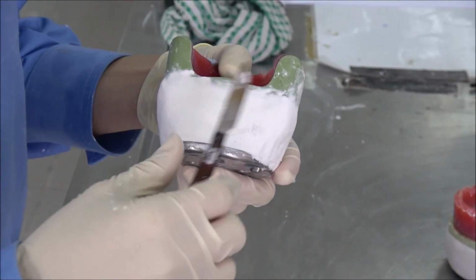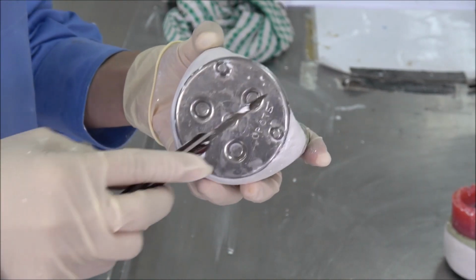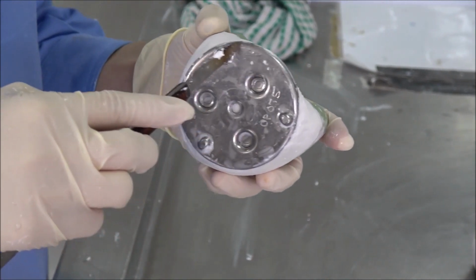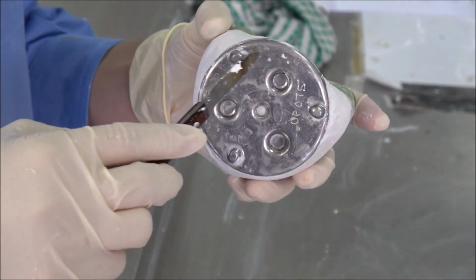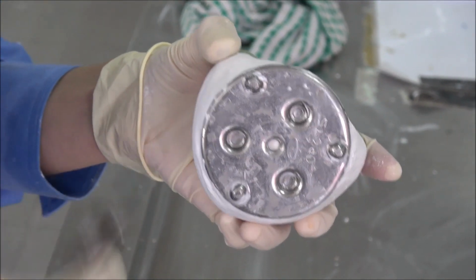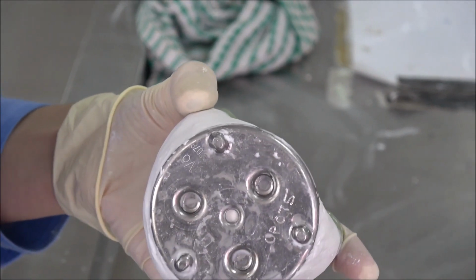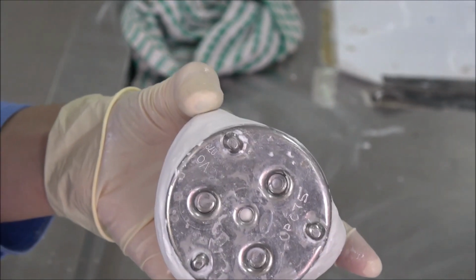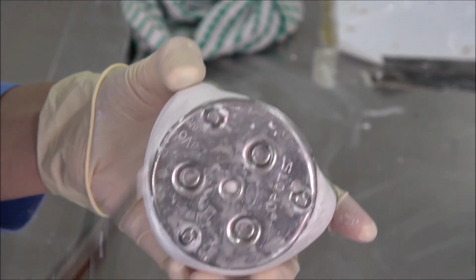When you are adding, make sure your POP doesn't touch our mounting plate here. Make sure there is no POP here. Okay? If there is POP here, later on when you fix back to the articulator, there will be a high bite here, so your bite will not be accurate. Please pay attention to this. No POP on this area.